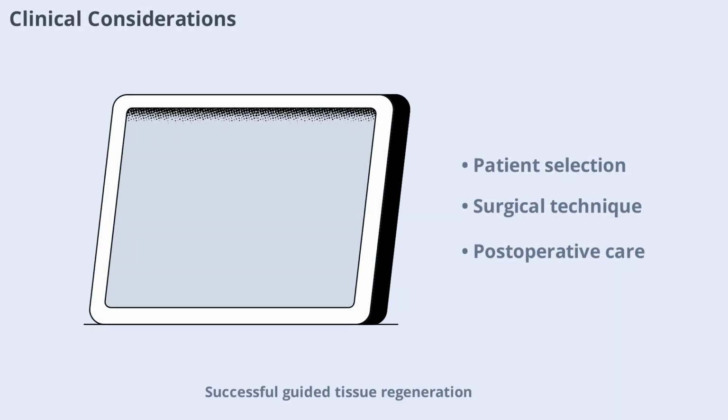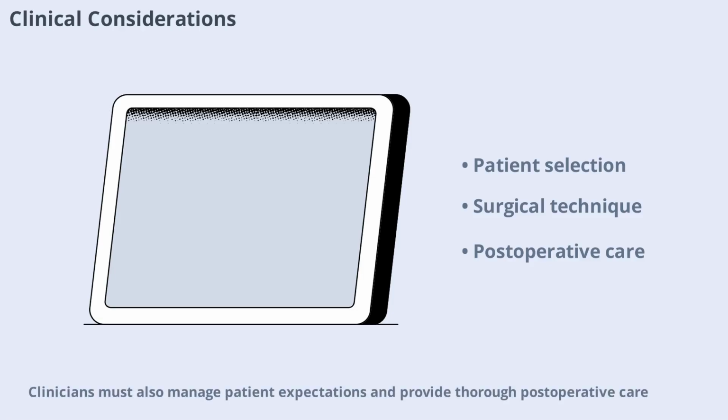Successful guided tissue regeneration requires careful patient selection, meticulous surgical technique, and appropriate material choice. Clinicians must also manage patient expectations and provide thorough post-operative care to ensure optimal healing and long-term stability of the regenerated tissues.